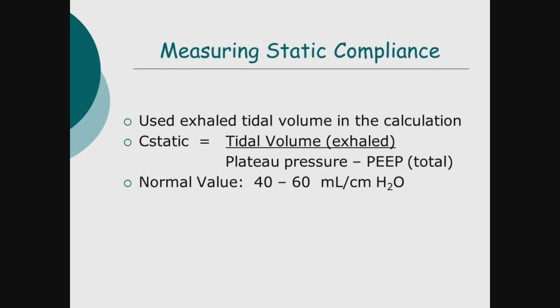40 to 60. So if it increases, their level of 80 actually is a decent number. I wouldn't say that that's stiff at all. When you say stiff, I'm talking 30, 25. Okay, now we're talking about compliance. We're not talking about plateau pressure. Right, make sure we're making that distinction. She was talking about the compliance. Okay.